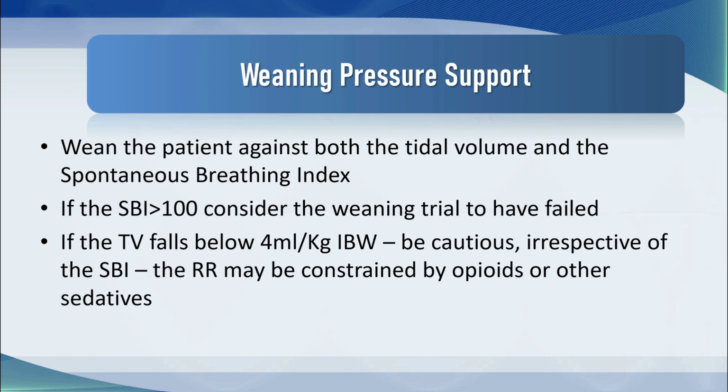If the tidal volume falls below 4 mils per kilo of ideal body weight, be really cautious, irrespective of the spontaneous breathing index, because the respiratory rate may be constrained by opioids or other sedatives, and the patient may be failing, but not failing obviously.